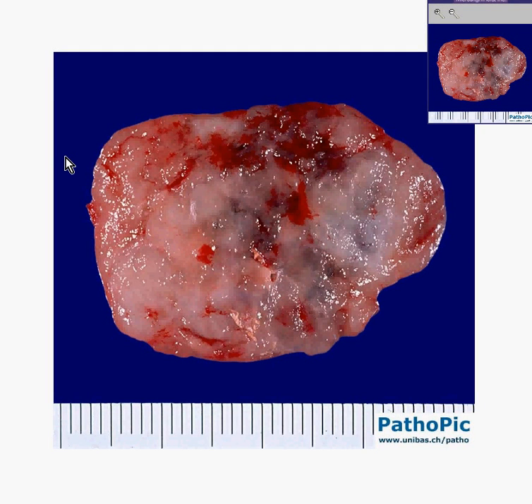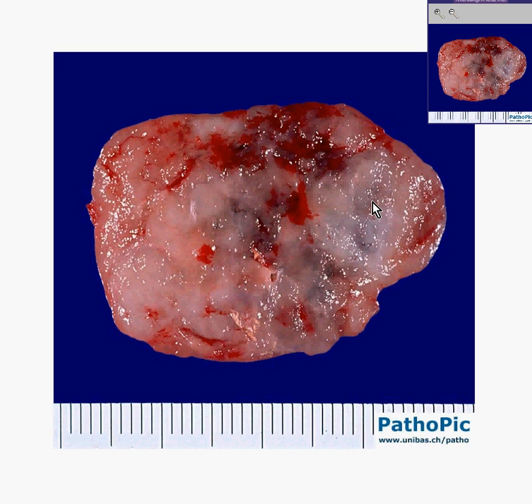Now that we have told you that the Warthin tumor was the second most common benign tumor of salivary gland, we would be remiss if we didn't show you the most common type. Not only is this the most common type of benign salivary gland tumor, it's by far the most common type of salivary gland tumor of any type. This is a mixed tumor — it's also called a pleomorphic adenoma.